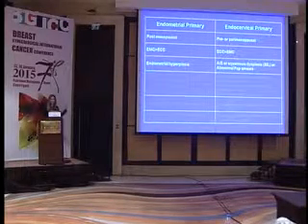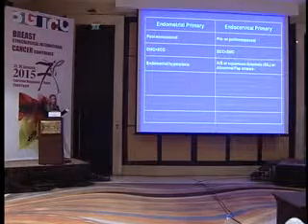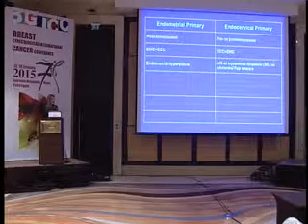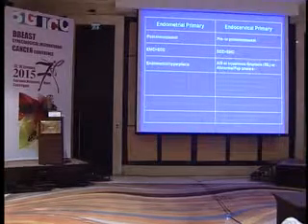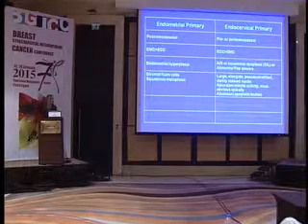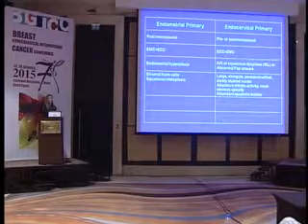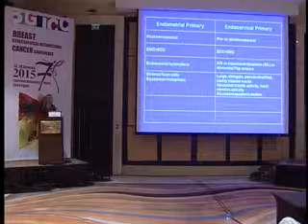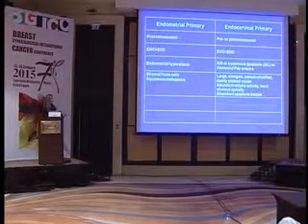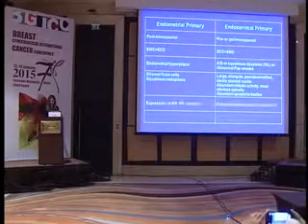And the background, if you are lucky, you get endometrial hyperplasia. The other one, AIS, has more apoptosis and mitosis, or if you're lucky, you'll get a squamous lesion with it. Really, I start looking at this: the foam cells might be very helpful in the endometrioid adenocarcinoma of the endometrium, and the squamous metaplasia. The other one, again, look for the mitosis and the apoptosis. It might be very, very helpful.